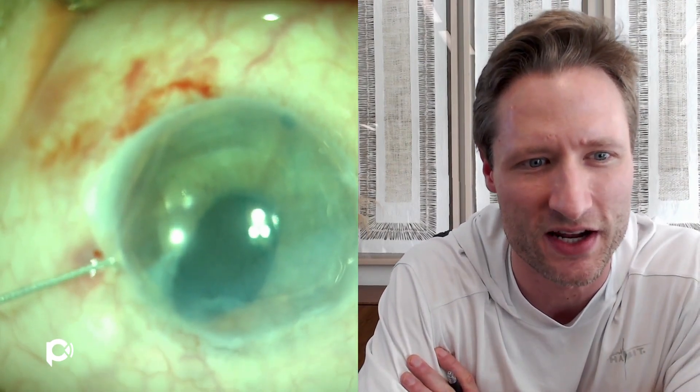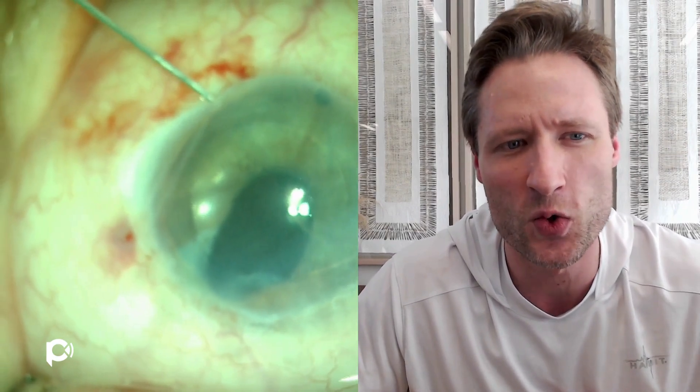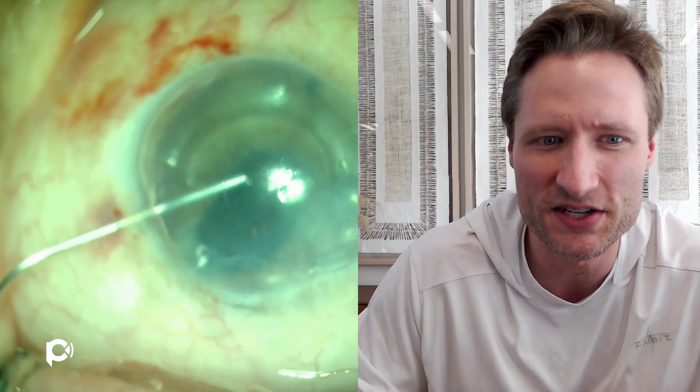All that remains is to put an air bubble underneath the graft and lift it. This is a big graft, so I'm sneaking the cannula in around the side to get underneath the edge without injecting air into the interface. This takes a little exploring — I'm trying different paracenteses to find a vantage point to get up underneath the graft. Eventually I find a spot where there's a little separation between the corneal periphery and the graft edge, sneak up underneath it, put an air bubble in the anterior chamber, pressurize the eye, and this is the end of the surgery.